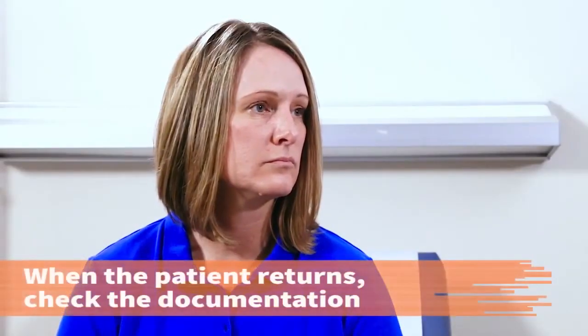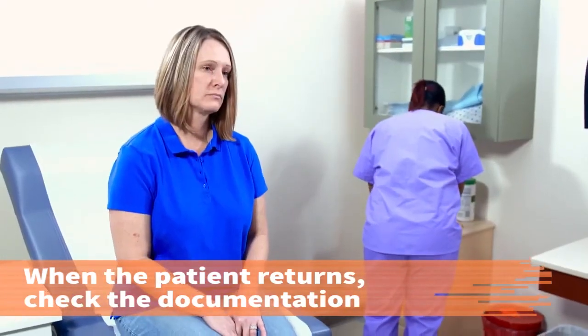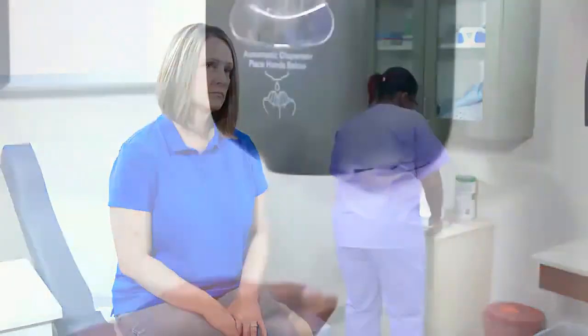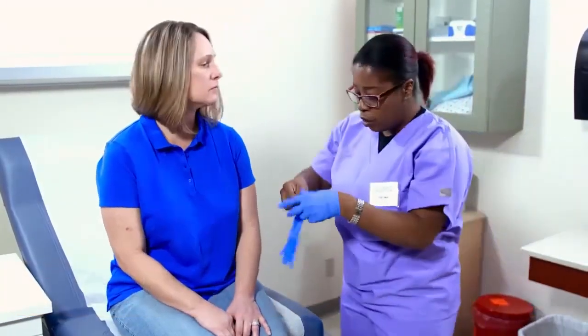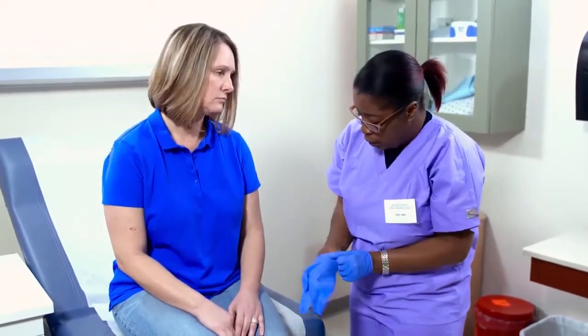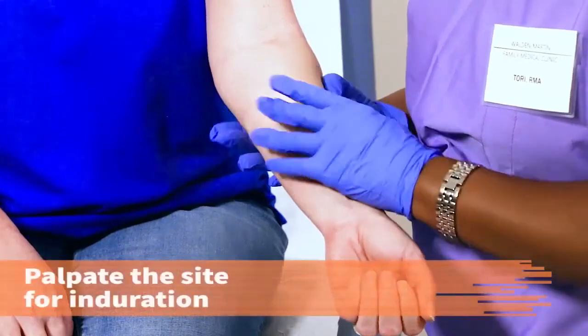When the patient returns in 48 to 72 hours, check your documentation to identify the location of the test. Sanitize your hands again and put on gloves. All right, Tina. I'm going to take a look at your left arm where we gave you the TB injection. Palpate the site for an induration.